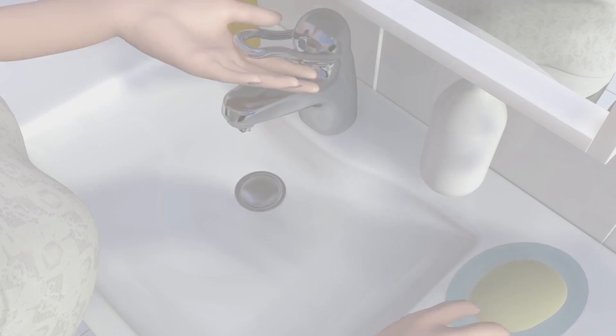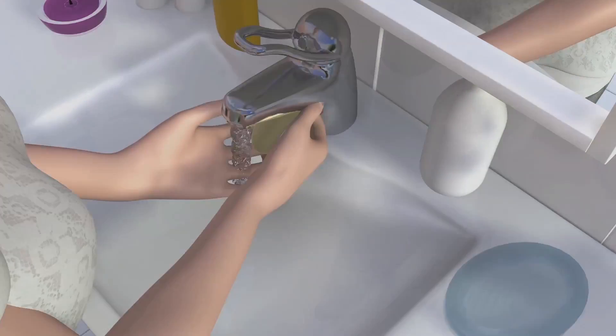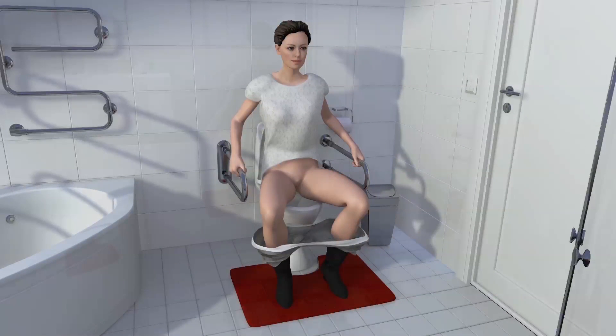Before you begin, wash your hands. Choose a position to catheterize that is most comfortable for you. It may be sitting in your wheelchair, on the toilet, or lying on a bed.